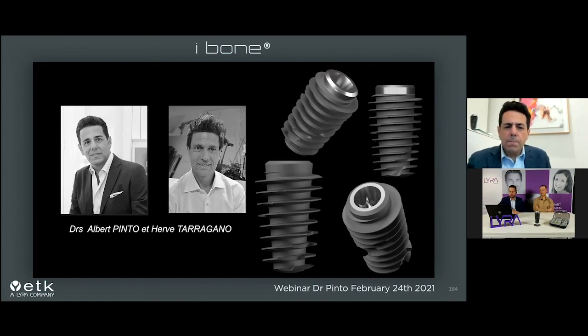Yes. Sorry, Dr. Pinto. Maybe a question for Mr. Lancieux regarding the digital library available for this complete guided surgery kit. Are they going to be available on the different software on the market? So today we have FreeShape. We are working with FreeShape.